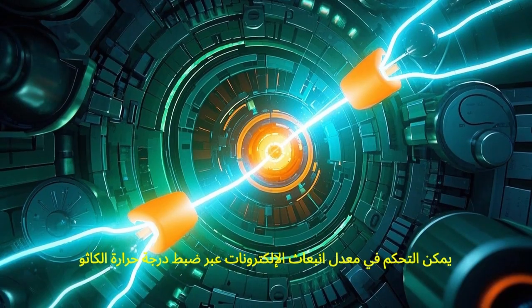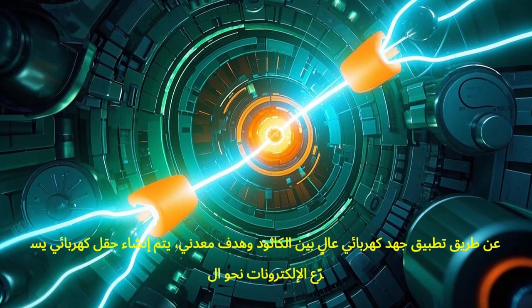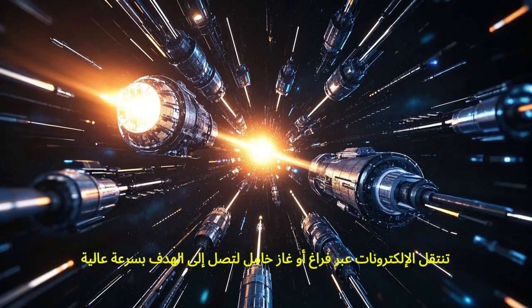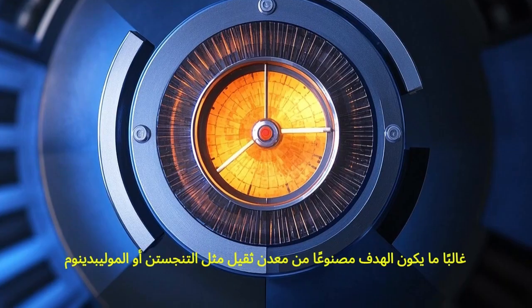By applying a high voltage potential difference between the cathode and a metal target, an electric field is established. This electric field accelerates the electrons towards the target. The electrons travel through a vacuum or an inert gas and reach the target at high speed. The target is usually made of a heavy metal such as tungsten or molybdenum.